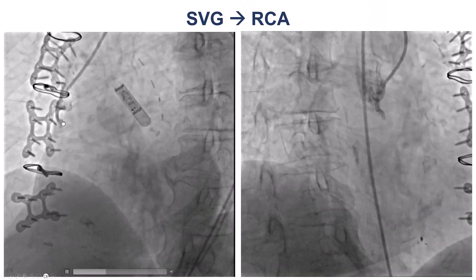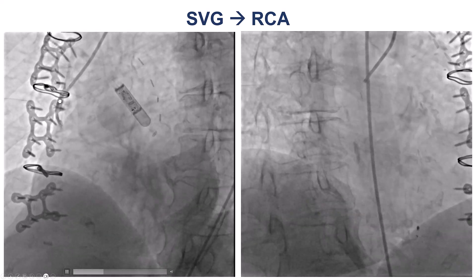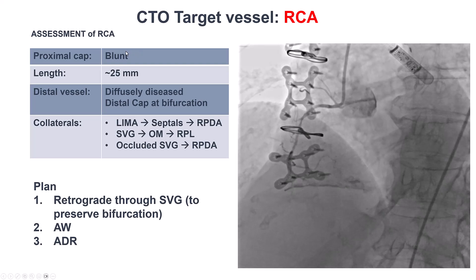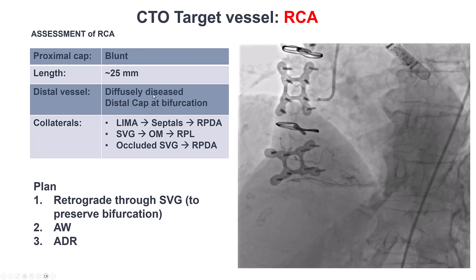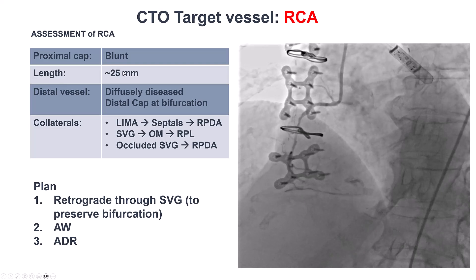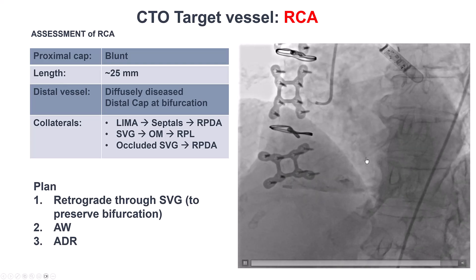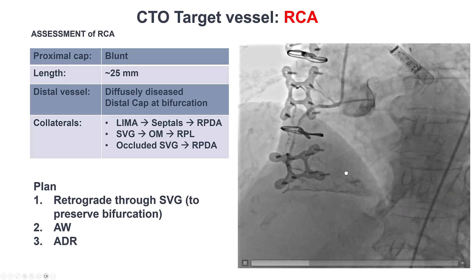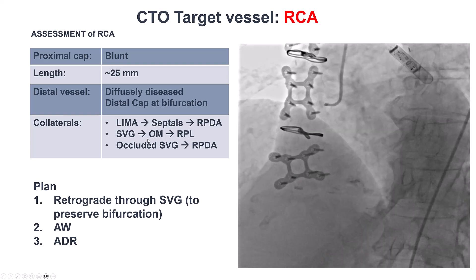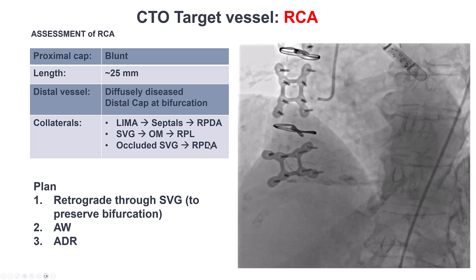This is the occluded saphenous vein graft. The occlusion is shortly after the aortic anastomosis. To summarize, we have a CTO of the right coronary artery with a blunt proximal cap. Length was difficult to assess without dual injection, but seemed to be about 25 millimeters. The distal vessel was diffusely diseased with a bifurcation on the distal cap, and there were epicardial collaterals and this occluded saphenous vein graft to the PDA.